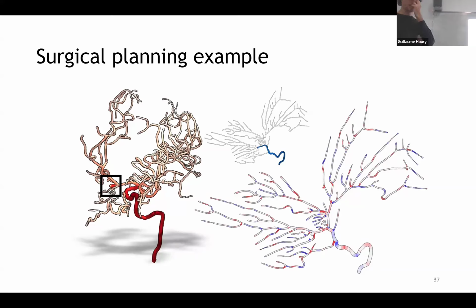But you imagine that when you have those very high-risk interventions, you'd be happier if you could succeed on the first try all the time. And that's basically what those visualizations are there for. It's to try to let young or not very well-trained radiologists very quickly assess how difficult the path is going to be, and therefore hopefully pick the correct set of tools.